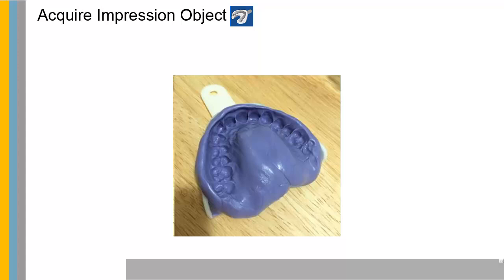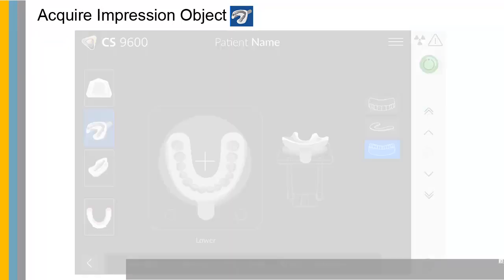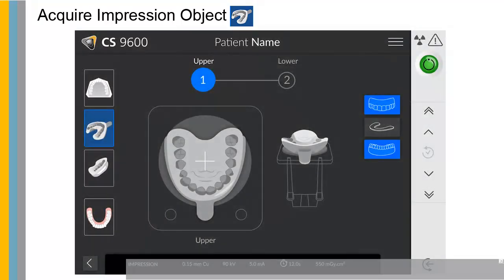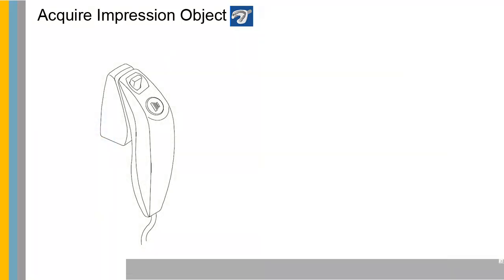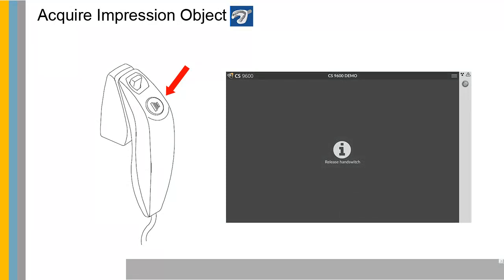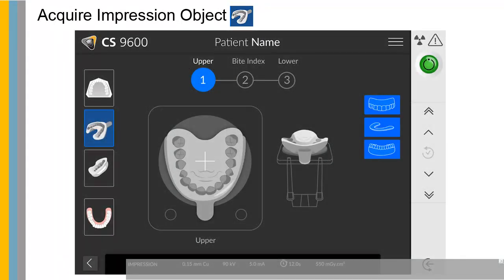Click to launch the impression acquisition. Select either the lower jaw or upper jaw acquisition mode. See the on-screen illustration on how to position the impression at the center of the black foam. To acquire the bite index, select the bite index acquisition mode. Launch the X-ray with the remote control. Press and hold the exposure button until the end of acquisition is indicated by the on-screen release switch message. When the acquisition ends, the acquired image appears on your screen. Repeat this process for each object.